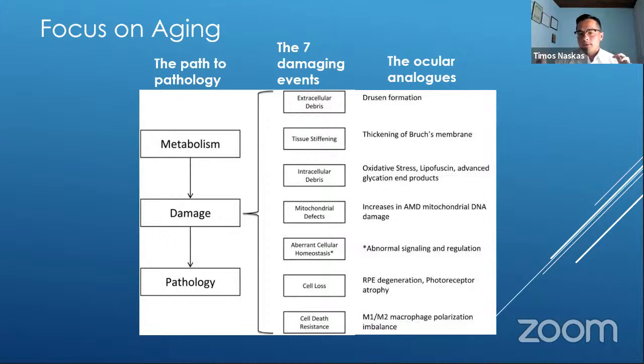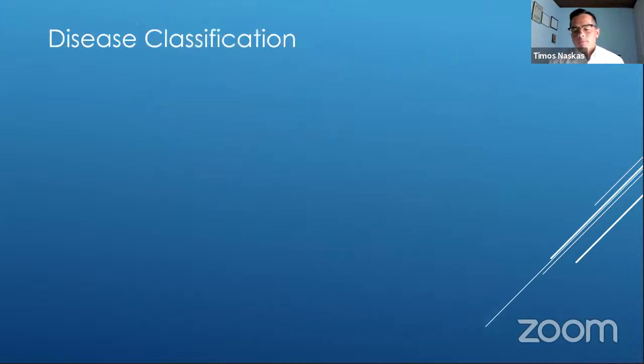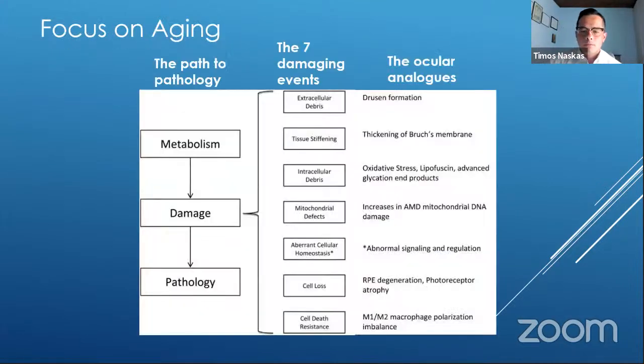So through a clinical examination, and OCT has its importance here, through an ocular examination with the OCT, we can reduce the latent period, but of course we cannot modify the induction period for a disease. And I will go back 1 slide.